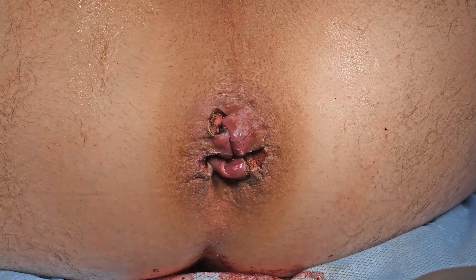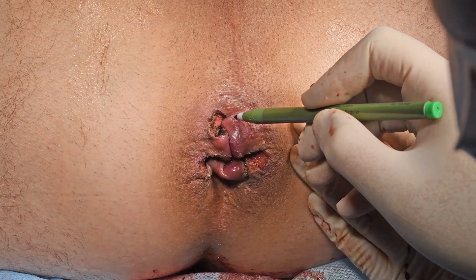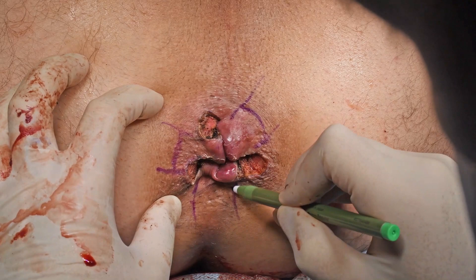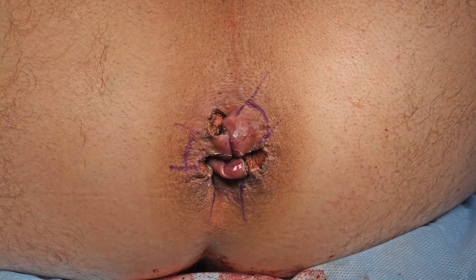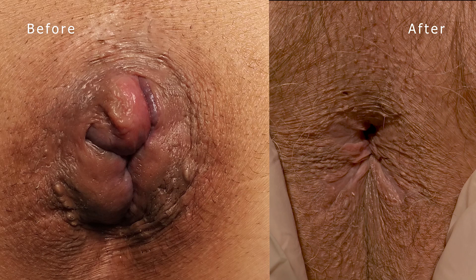The size of the removed haemorrhoidal cushion is approximately 2 cm, and the width of the mucocutaneous bridge is 2 cm. Pre-operative and post-operative pictures of the patient are shown. At one month follow-up, good wound healing was achieved and the patient did not complain of prolapse or anal bleeding.